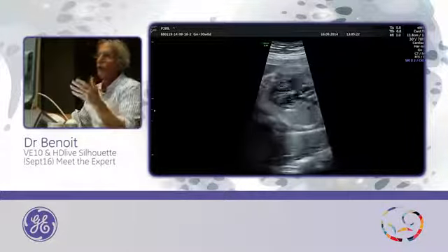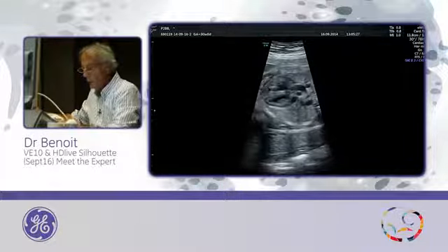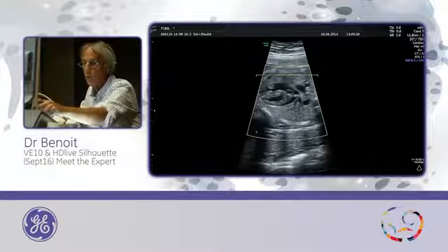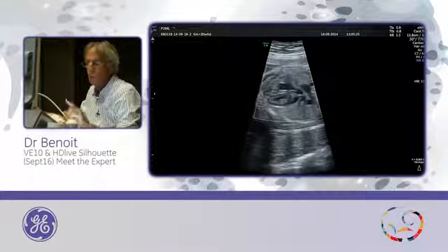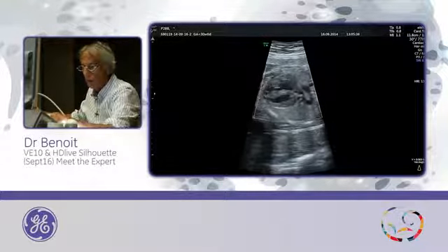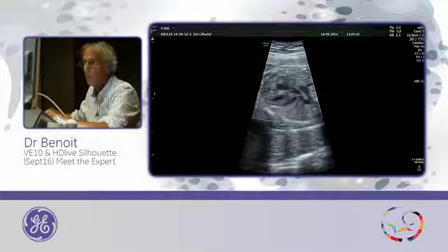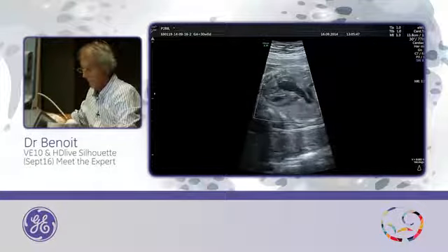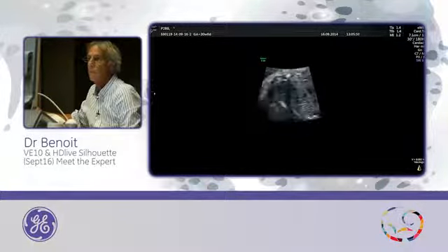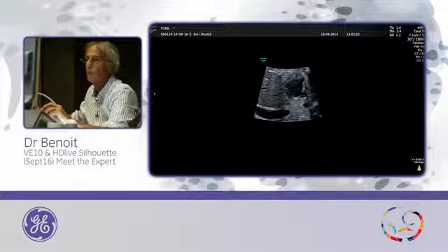So you know, for the heart, you can do a 2D examination. You can do acquisition with a STIC, and with the STIC, the acquisition is quite fast. I will do it with quality high, volume angle, I will choose 40. Now I start. So this is the acquisition, and you will see the quality of the STIC. It's really good.